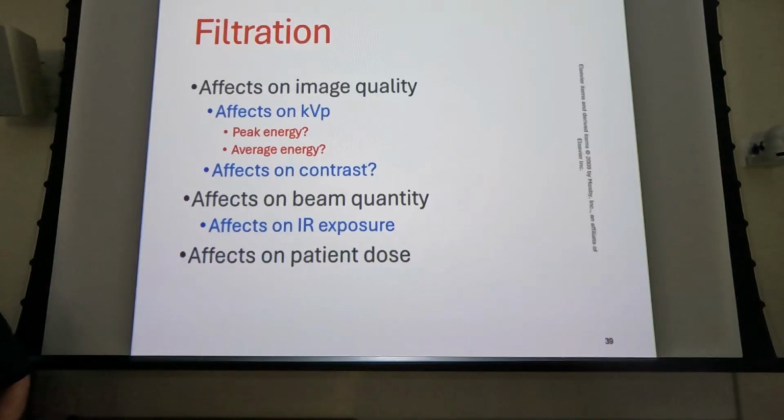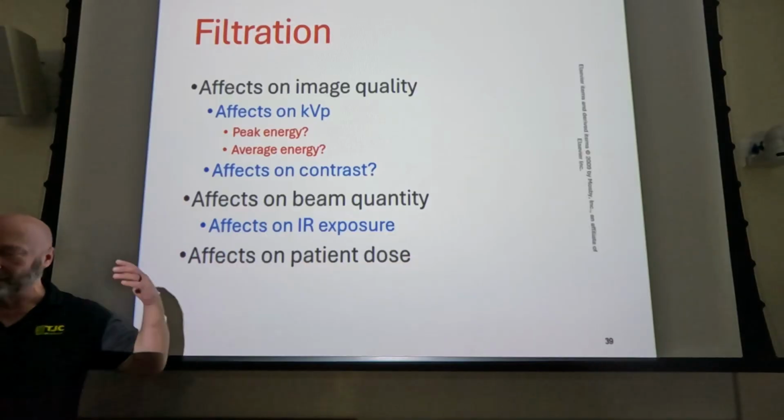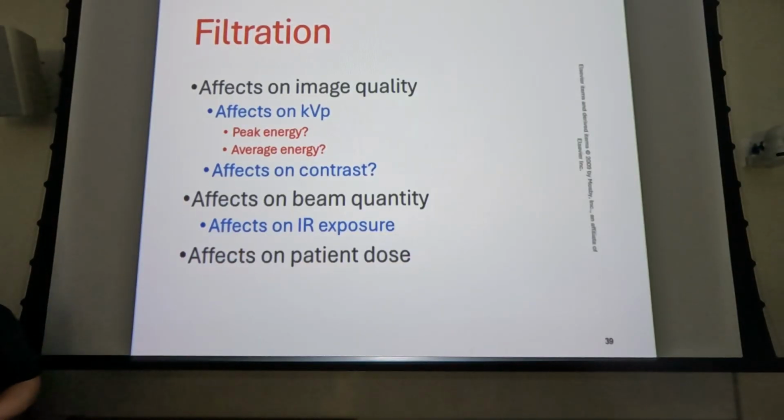So the things that really affect your contrast on your image are three things: patient size, tissue density, tissue type essentially, and the computer algorithm that you process your image with. There are some things, like if you leave your collimator open, you get too much direct exposure to the image receptor, and you have basically an error in the processing of that image, that could affect it as well. But assuming that you did everything right, these things don't affect your image quality all that much anymore.